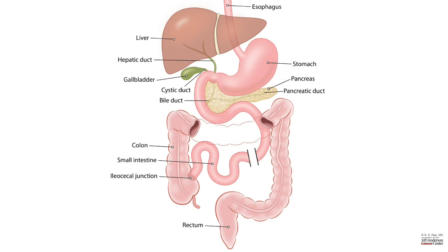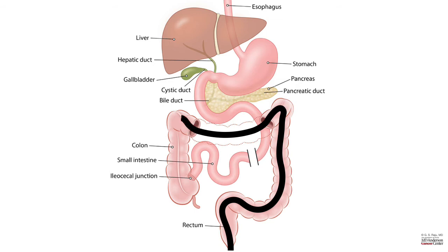It goes up the anal canal through the rectum, sigmoid colon, descending colon, splenic flexure, transverse colon, hepatic flexure, ascending colon, cecum. That is where the opening of the appendix is and also the opening of the small intestine or the ileum. With the colonoscope, you can also enter the ileum. So, you can see a lot of stuff in the colon and also treat any problems in the colon.